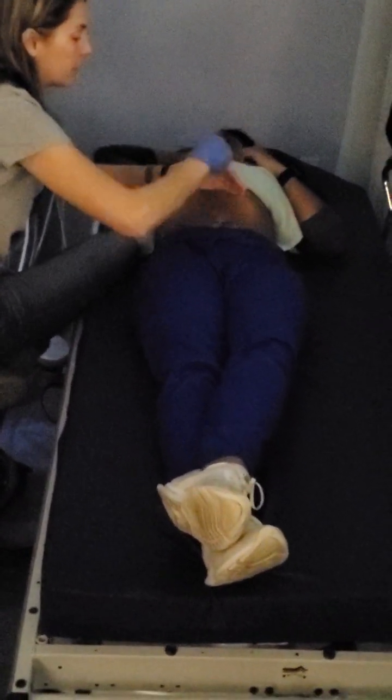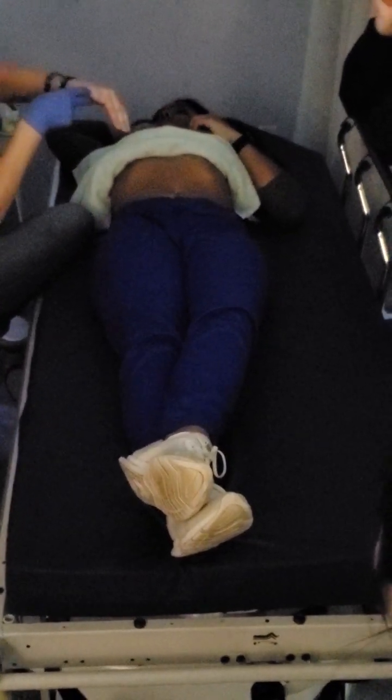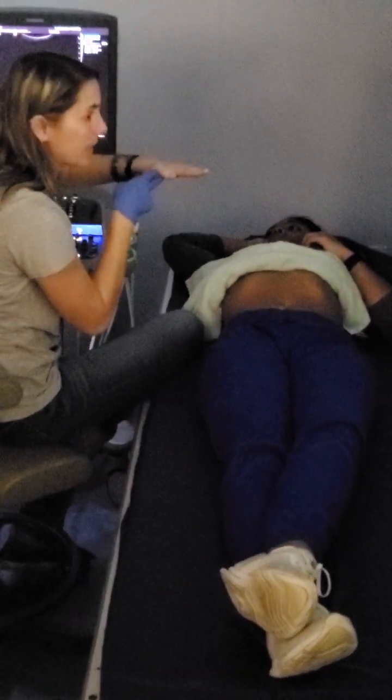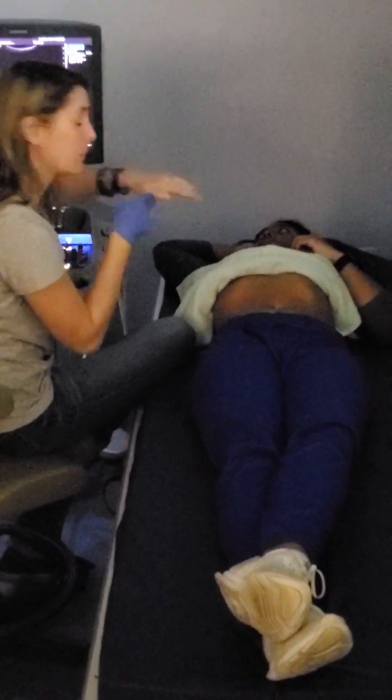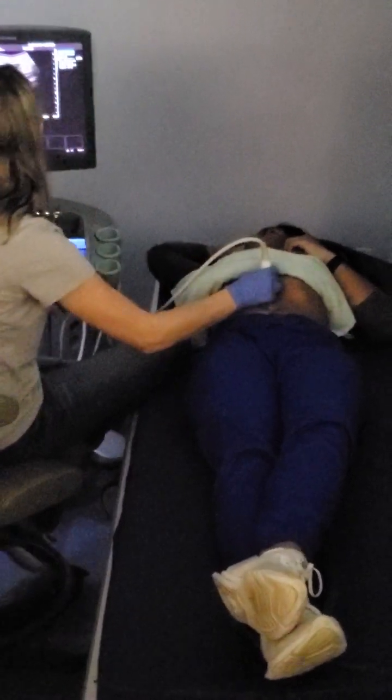We looked at this in length this way. Now we're going to look at it this direction. So we're going to look at where that SMV, IMV actually plug in. So we're going to see main portal vein in cross section, and we're going to see that SMV, IMV plugging into it. So we're going to be sag on the body, and go ahead and begin.